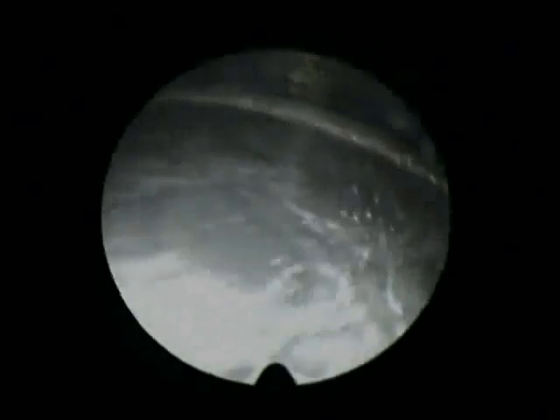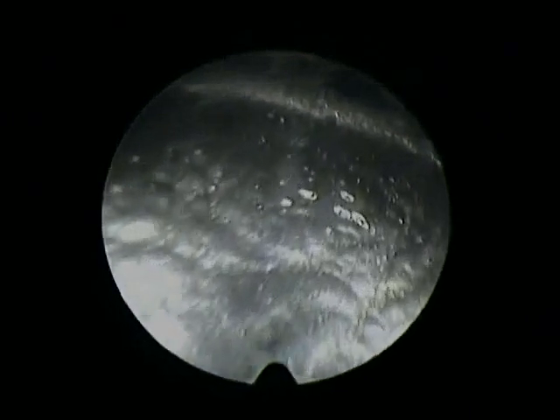So this exercise has been done by a beginner. It was her first experience with the hysteroscope, her first experience ever. So just pay attention to the slowness of her movements. That's how it should be done. Really slowly, never aim to be quick. Well, now she got inside the bag, and she's moving slowly.